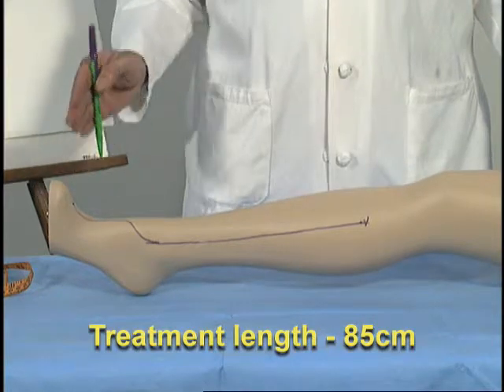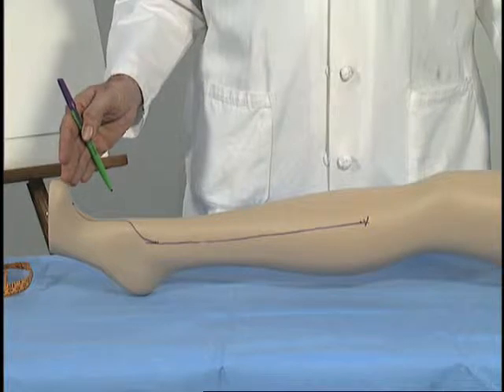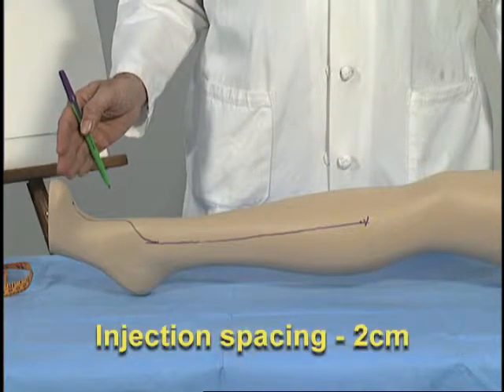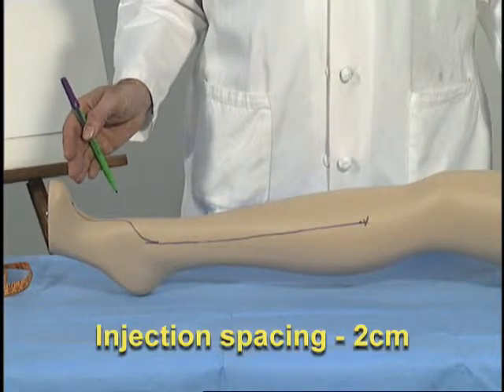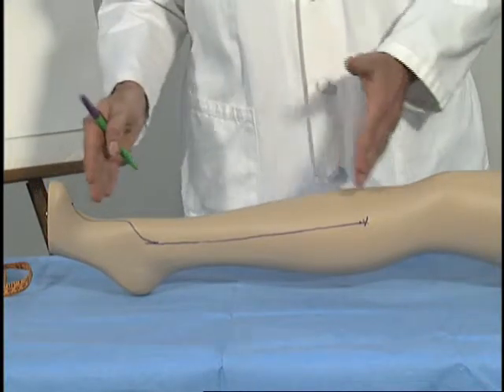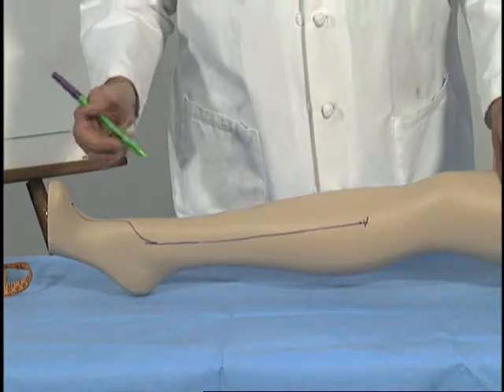Given that we have, again, 40 injections which can be used for this leg, we'll divide our 85 by 40 and get about 2. Our treatment interval, our maximum spacing for this protocol, is 2 centimeters. So if we need to move up or down slightly to accommodate that, that will be done.